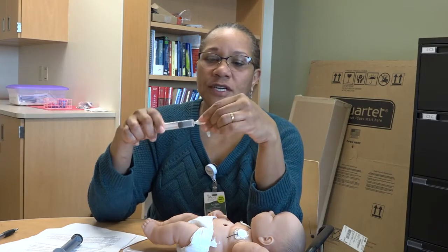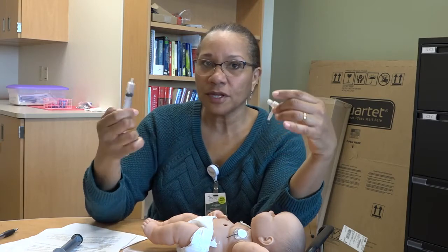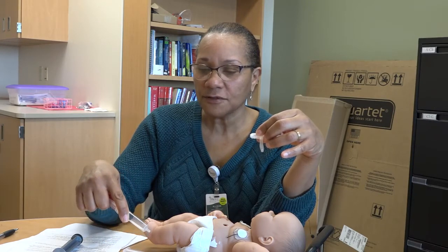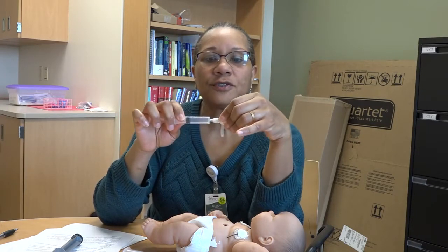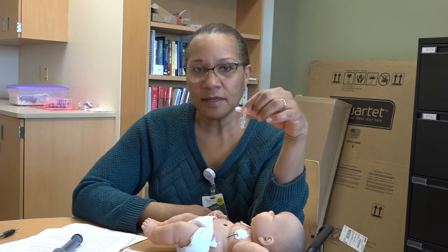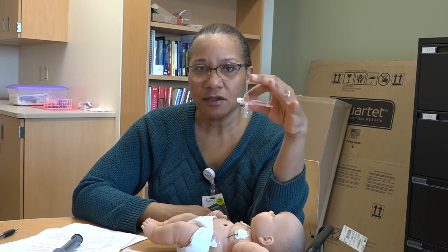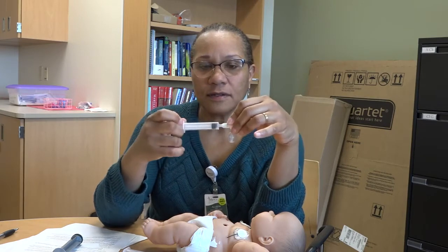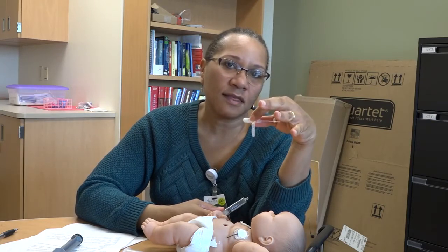So you're going to check and see how much water you have in the balloon, and let's say you know there was supposed to be 5 in there, but there's only 3 milliliters of water. So we would ask you to refill to 5. So you would put 5 milliliters of water back in your syringe. You're going to put that into the retention balloon port, and then we're going to ask you to wait about an hour and a half or so, and then go back and check your balloon volume again. If you have the same amount of water, the 5 milliliters is what you get back, then we know pretty certain that there probably isn't anything wrong with the balloon.